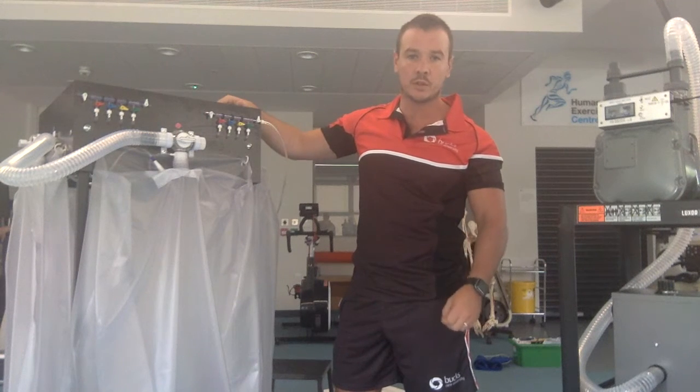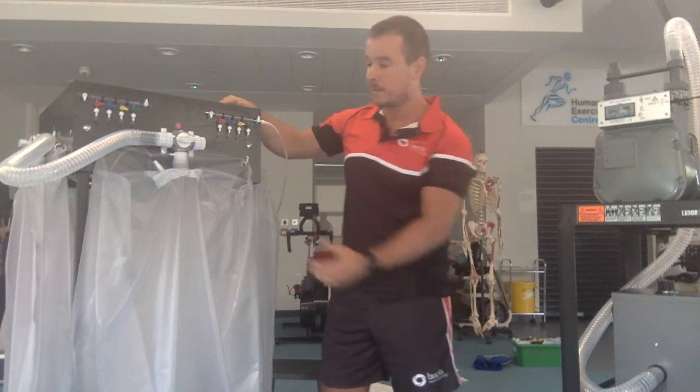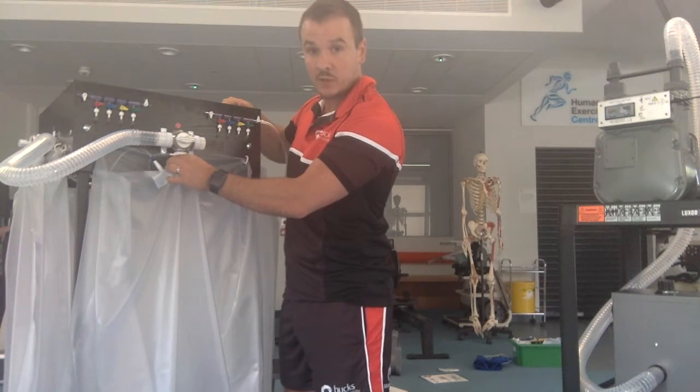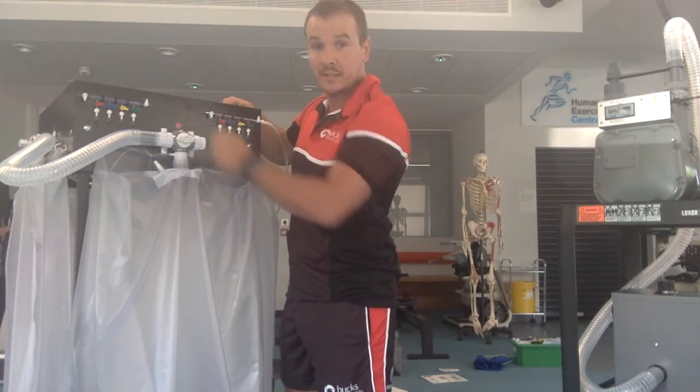At this point, you should make sure that there are no obvious leaks. So make sure that the plastic tubing is all tightly connected and that each of these four Douglas bags are tightly connected to their tap.